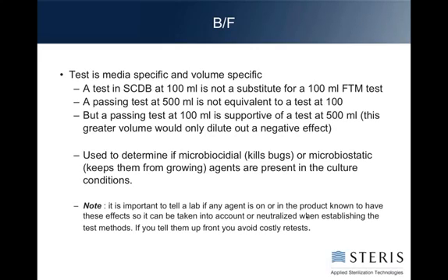It is important, especially when you're dealing with a new product in a lab, that if you know anything about the product having an antibacterial property to it, meaning it has an antibiotic on it or it has some natural material on it that's known to be antibacterial, that you let the lab know before they test it. In many cases, they can take that information into account when developing the test, or find a way to neutralize it and save you the cost and time of having to repeat a test to get an optimal result. If they know upfront what could be a potential cause of a problem, they can address it right from the start.